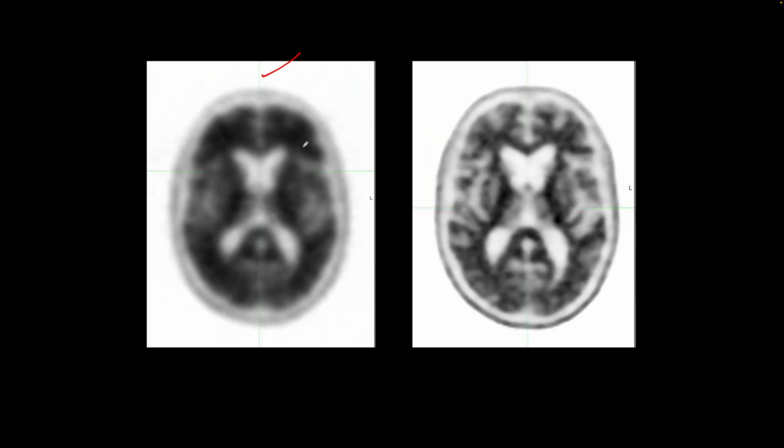The image on the left is before, showing positive study with high plaque burden, and follow-up treatment shows significant clearing of the burden, and the Centiloid score decreased from 140 to around 35 post-treatment.